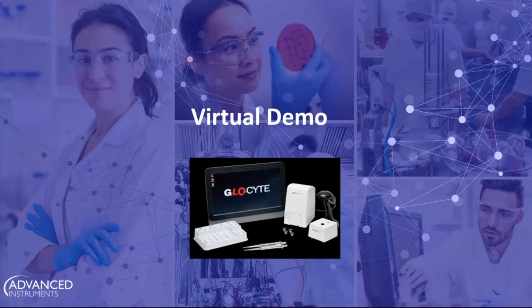I could hear you a little choppy, but just to kind of reiterate Jordan's whole demo here, you saw really, and hopefully you could see this just through the video, just how quick it is. She did all of one patient sample in less than 5 minutes. Think of how impactful that is. I just told you, even the best tech that's sitting in a hospital lab, probably this whole process takes them around 30 minutes.